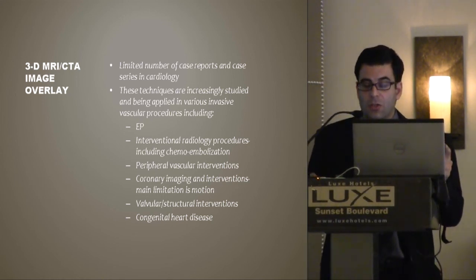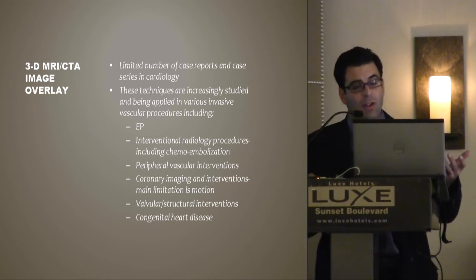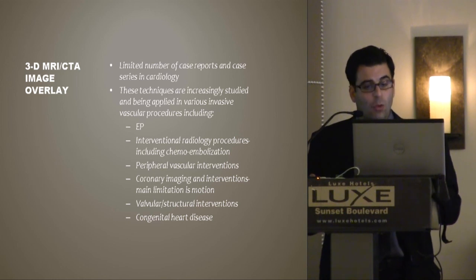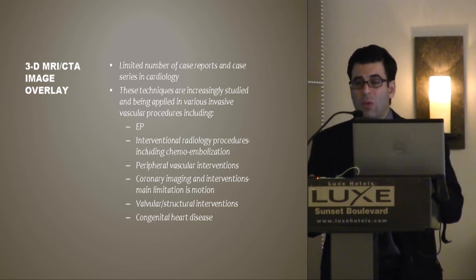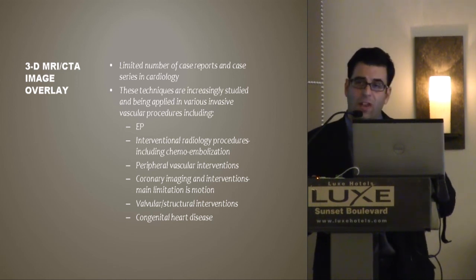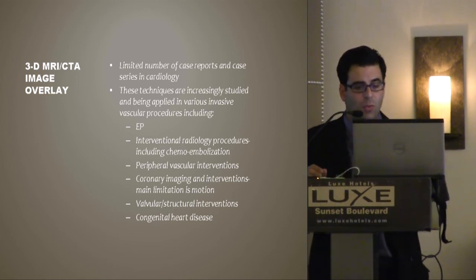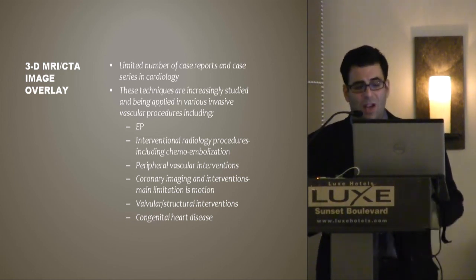Interventional radiology procedures like chemoembolization of tumors, peripheral vascular interventions, great for that, coronary imaging and interventions, but the main limitation there is motion. But I will show you that we have some very nice ways of actually imaging the coronaries using these techniques. Valvular and structural interventions, I'll show you implantation of a melody valve using one of these techniques. And congenital heart disease, which is really the focus of this entire talk. But really, there's just a handful of case reports and small case series in congenital heart disease using these techniques.